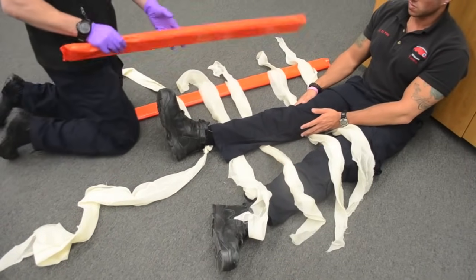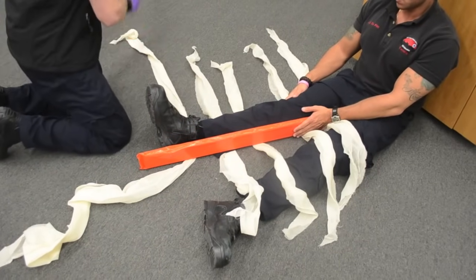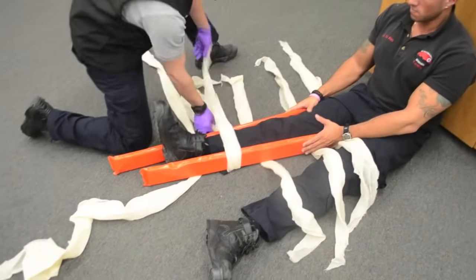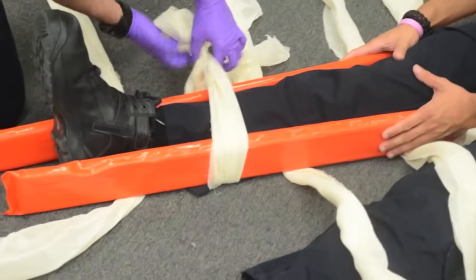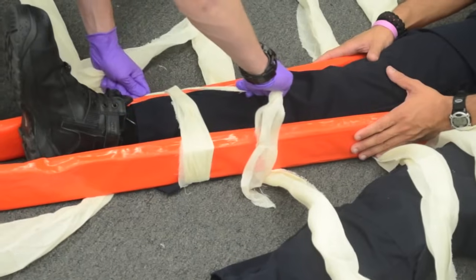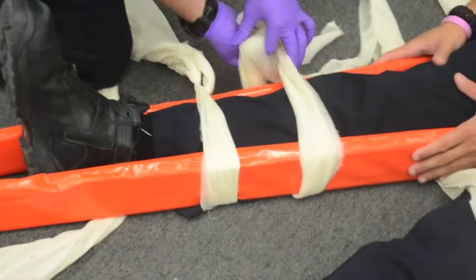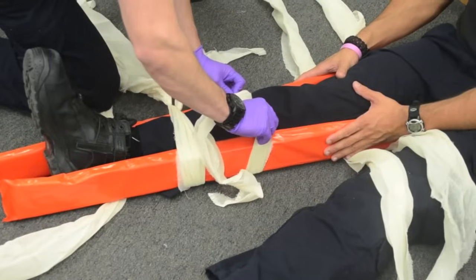I am going to take my board splints, making sure the foam is on the inside, and put those into position. I am going to tie the knots against the side of the board.